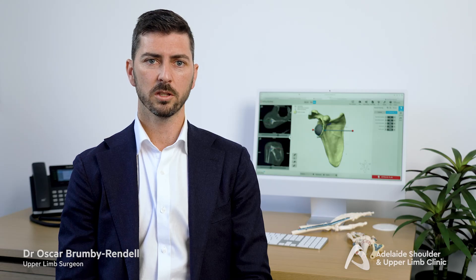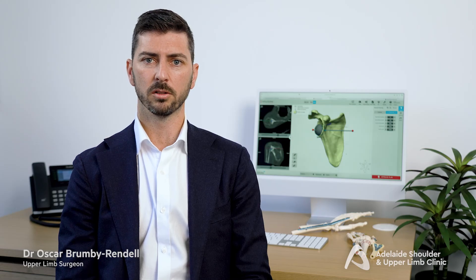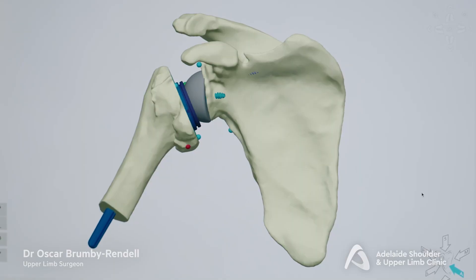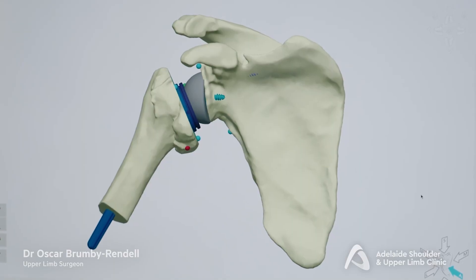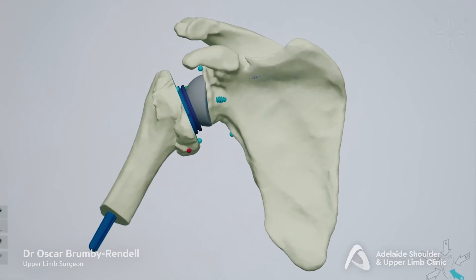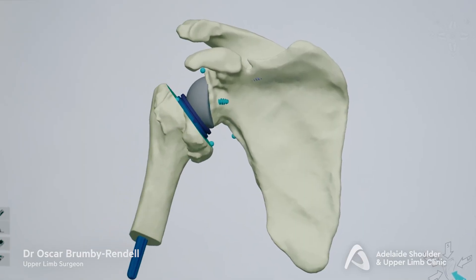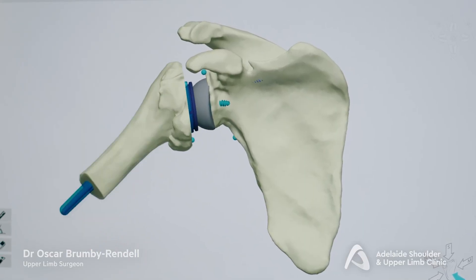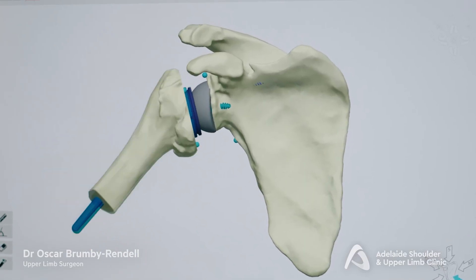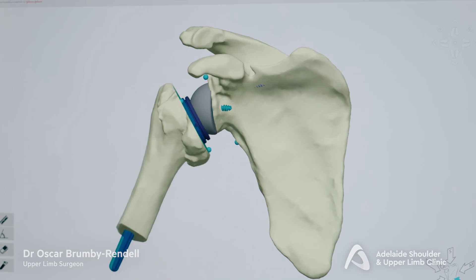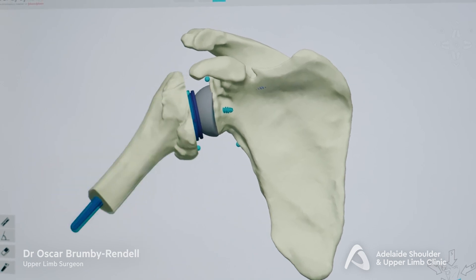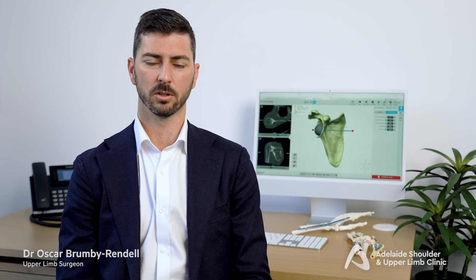Once we've decided on the best spot for the glenoid side, we then put the humerus or stem side in. We can then see how these two components will work together in motion and adjust the size or position to maximise range of motion.